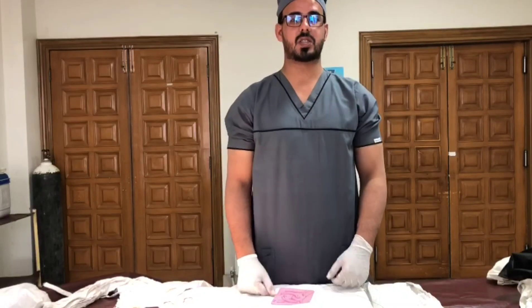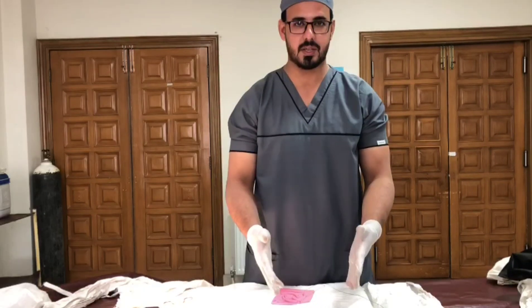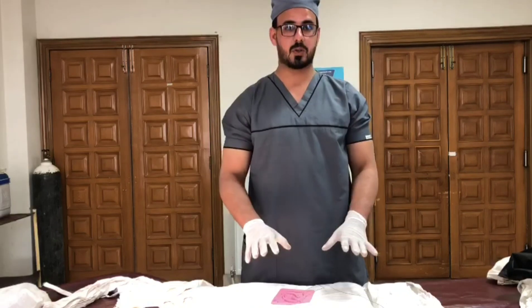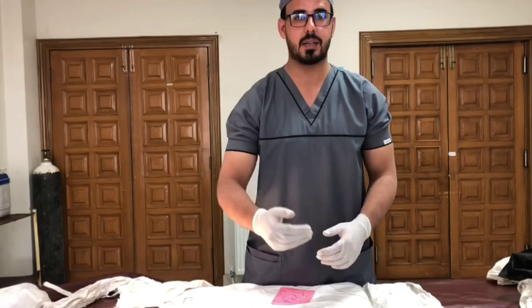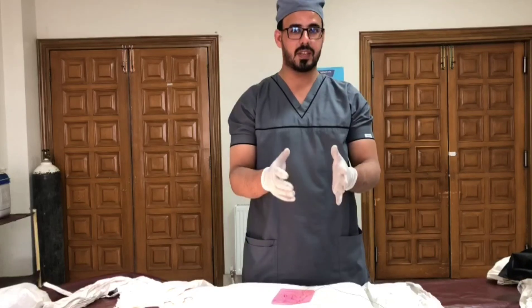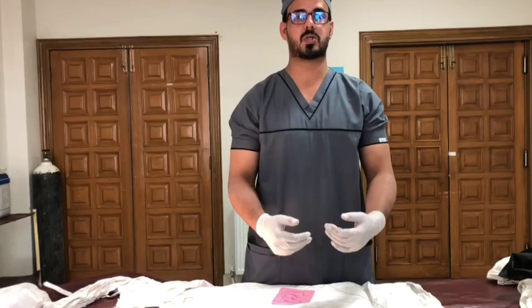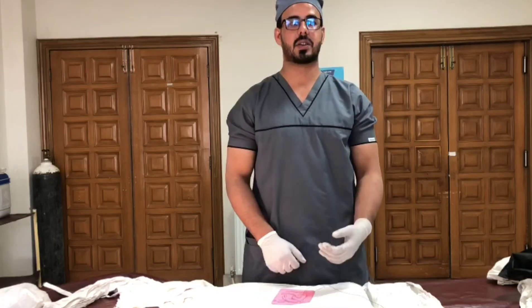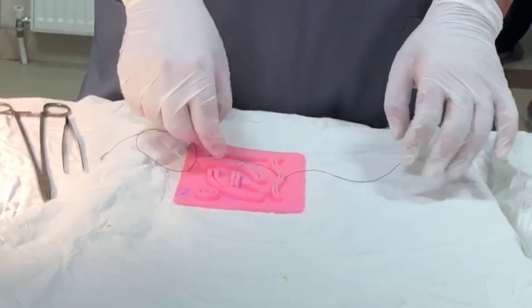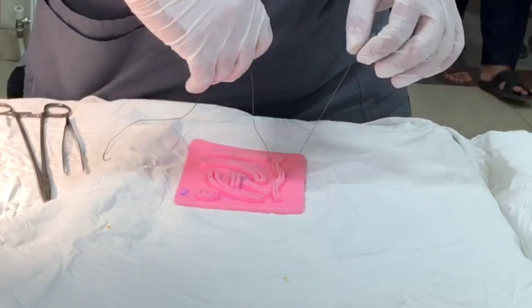In previous videos I demonstrated the two-handed reef knot and two-handed surgeon's knot, so now I'm going to demonstrate the one-handed reef knot with a single hand — the right hand, because I am right-handed. Here, the short end is away from me and the long end is towards me.